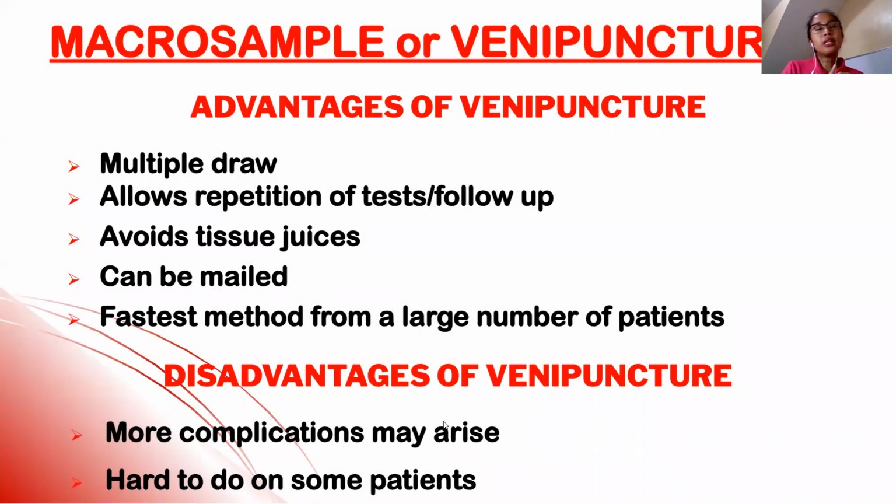So, dito na tayo sa macro sampling. Skin puncture has its own advantages. Class, advantages talaga ang skin puncture, especially among infants, among adults who are burn patients, chemotherapy patients. But guys, may advantage at disadvantage rin ang macro sampling.